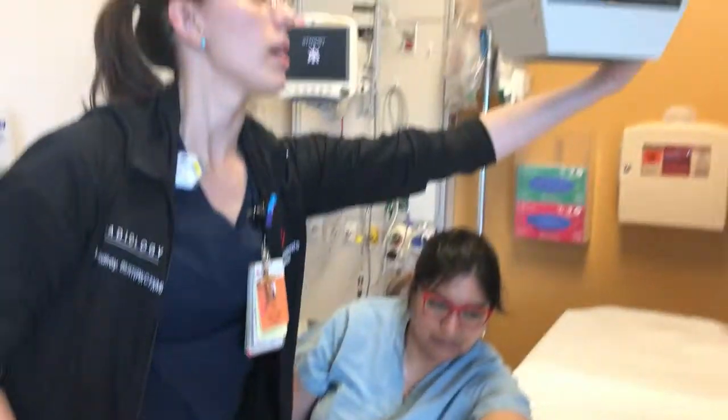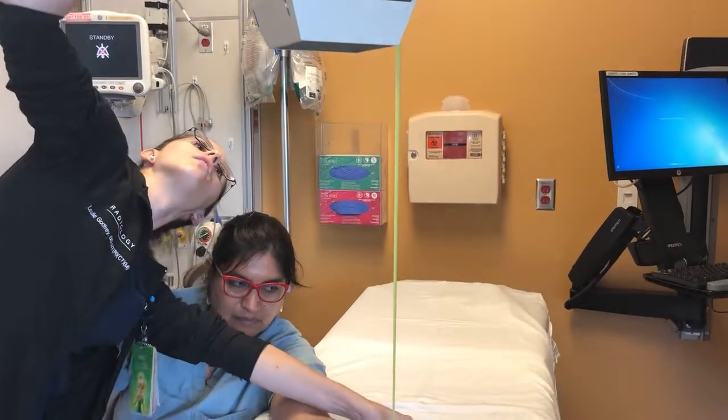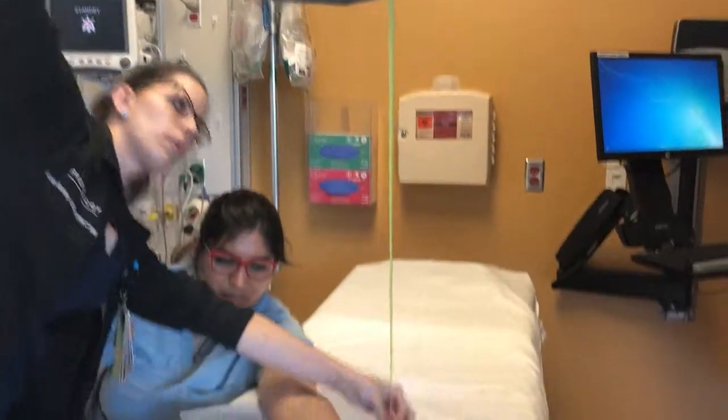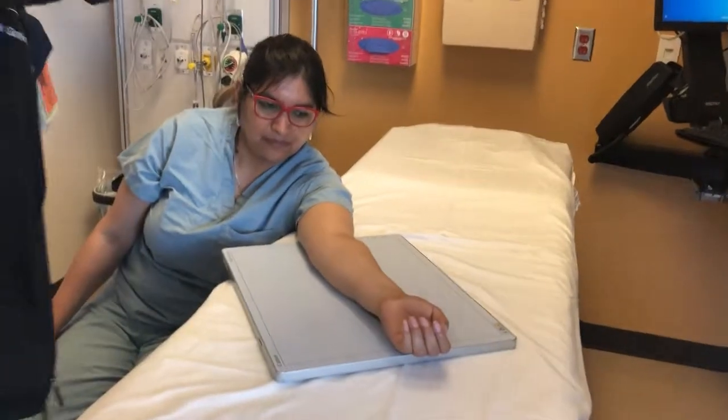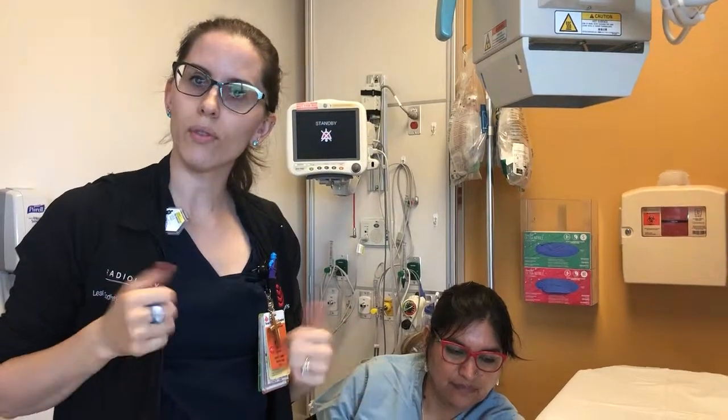And again, as always, make sure you are at 40. There we go. Perfect. There we go. And that's how you position for the AP view of the forearm.